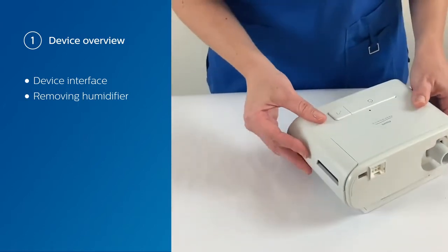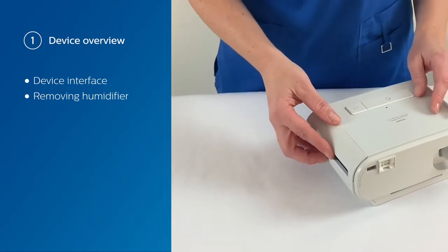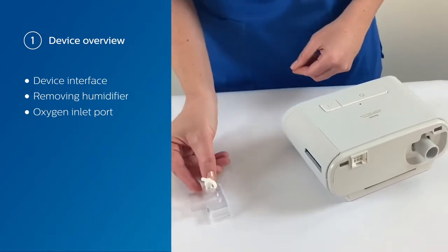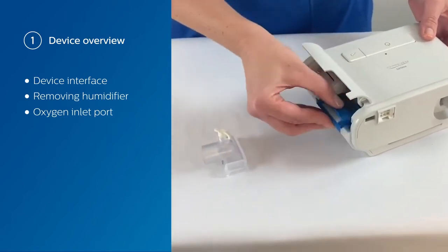What we're going to do now is go through one of the side panels here. The device is capable of delivering up to 60 litres of oxygen through a dedicated oxygen inlet port. We're going to install that now — simply open the side door and remove the blue filter.